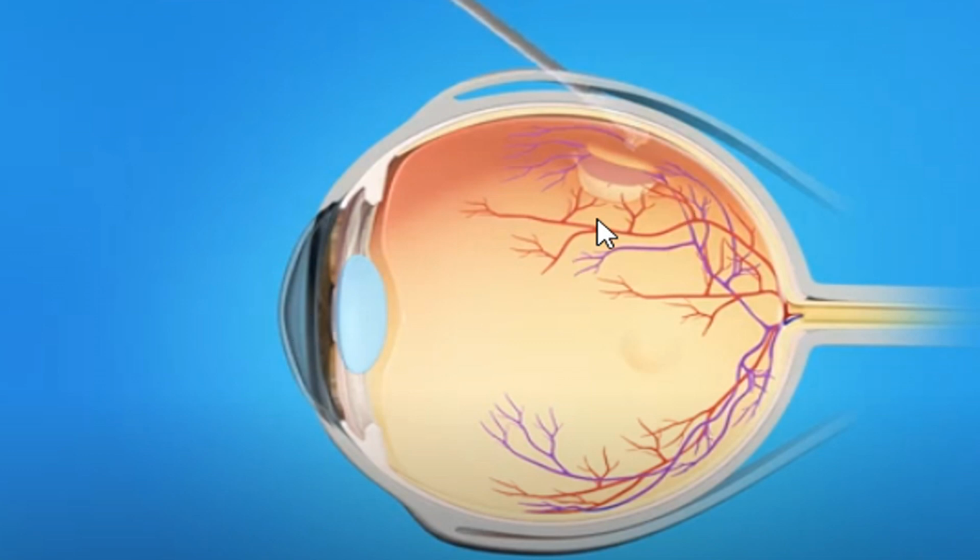So what are we using? Instead of dealing from inside the fundus, we are dealing from outside. Can you see? This is the cryoprobe. We are dealing from outside, from the sclera and the conjunctiva. That's why I'm telling you it is somewhat damaging to them. If you ask me what the difference between them is, actually the main idea is the same; we are just using a different tool. What is the main idea? We are causing fibrosis of this retina, so the tear and the fluid can no longer leak to the healthy retina. Cryo is a very low temperature that spreads here and causes death of cells, so it ends with fibrosis of this tear.